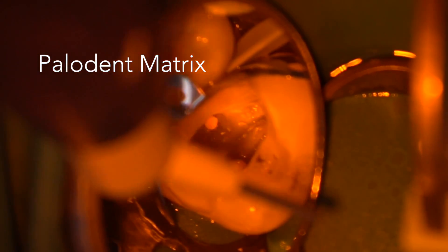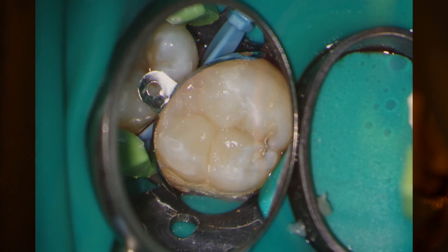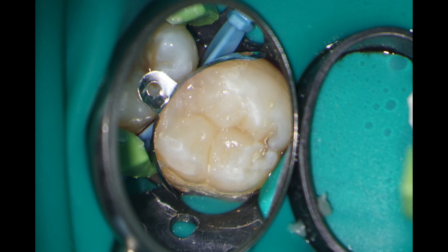I'm now restoring the cavity with composite. I've flipped the microscope onto the yellow filter so that it doesn't affect the setting of the composite. I've placed a palodent matrix with wedges and a separator to ensure really good contact between the mesial cavity of the upper left 7 and the distal part of the molar in front. After full etch and placement of bonding agent, I'm now bulk filling the majority of the cavity with a flowable composite called SDR. The occlusal anatomy is then built up in the standard way using light-cured composite.